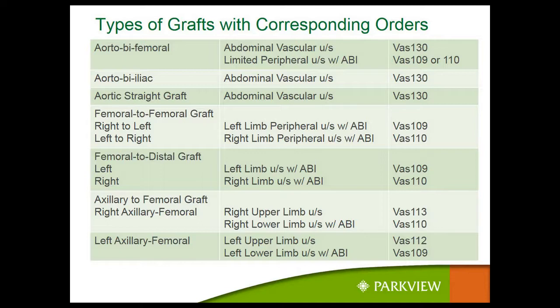Femoral to distal graft starts in the femoral and goes to the popliteal, above or below the knee, and it can go as far down as the ankle. And that depends upon which side, left or right.